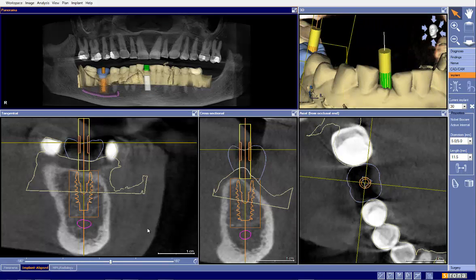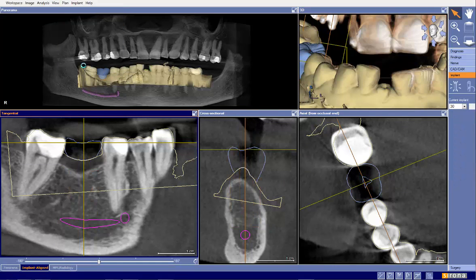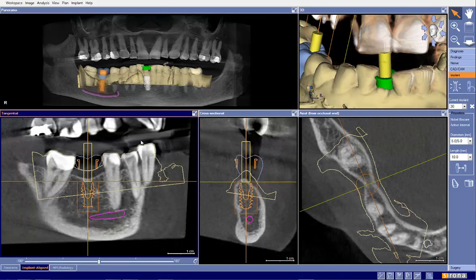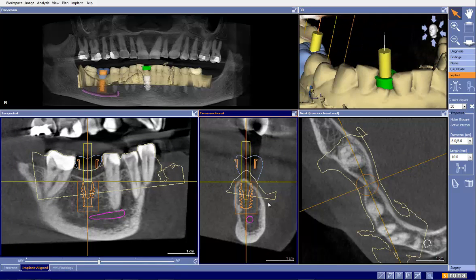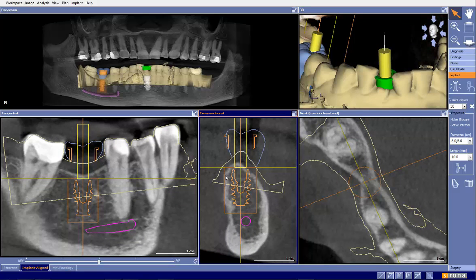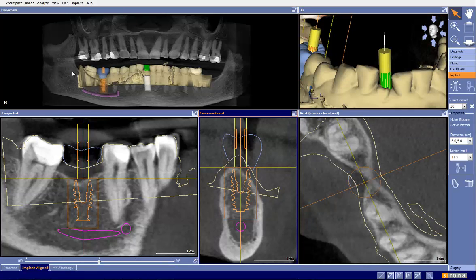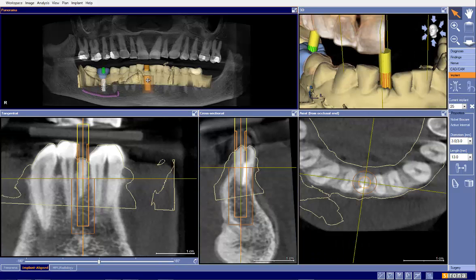Let's compare our plan on tooth number 30 to the original plan. In the original, the curve of Spee is not totally correct, and the implant is too close to the lingual — we leave more on the buccal than the lingual, which I prefer not to do. In the plan I created, the curve of Spee is better and we have better centering in the ridge, coming up to the bone level, with an acknowledged need for grafting. For tooth number 25, I didn't make any position changes — simply a size change to the 3.0 and a sleeve change. Thank you.